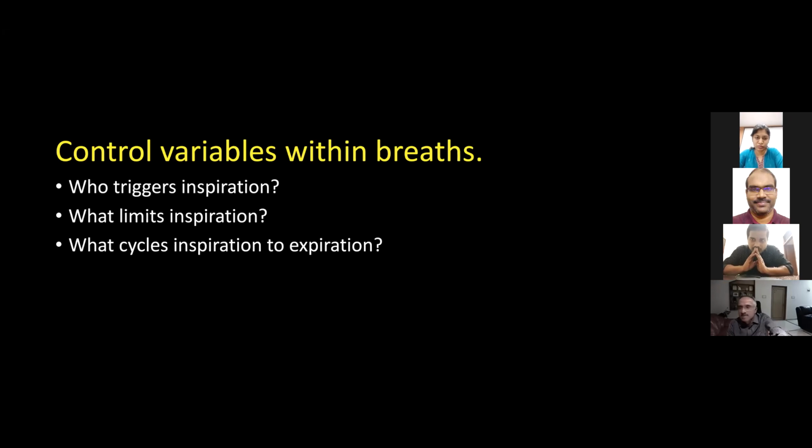What are the limits to the inspiration that a ventilator can be set to? Volume and pressure, sir. We have discussed that in volume ventilation, pressure changes, and in pressure ventilation, volume changes, and how to look at the tidal volume we have seen. So one part of the question you have already understood, and we know that. Now only 2 things we have to understand.